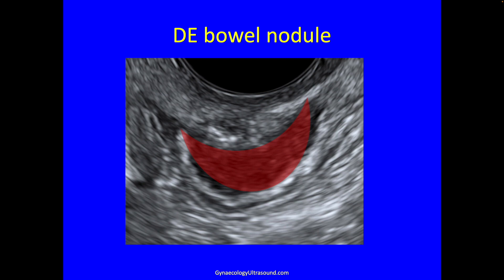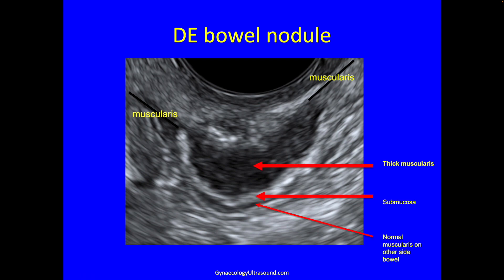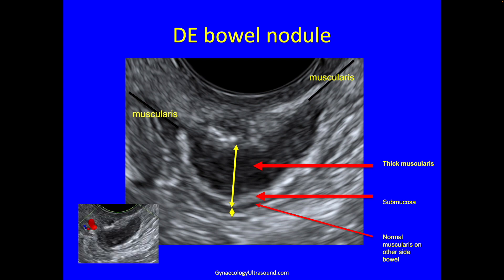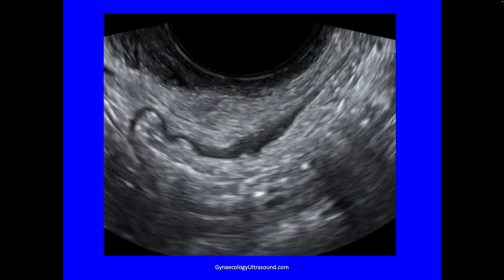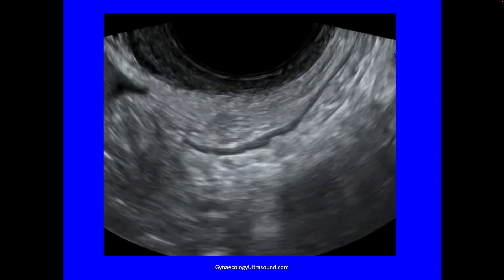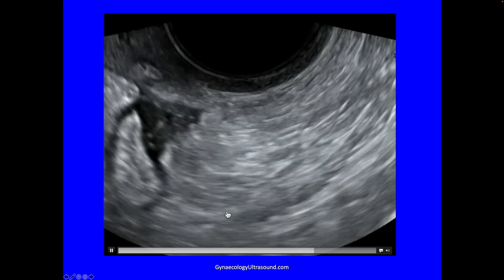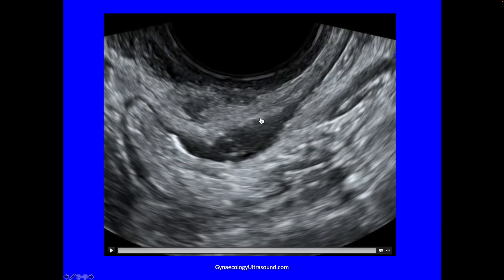Sometimes you will come across an abnormal bit of muscularis — it will have normal muscularis going in and out of it, and it is highlighted by very bright white, which is the submucosa and mucosa. Normal muscularis on the other side — the posterior wall is never affected by endometriosis — and you can see the disparity in the thickness of the bowel wall. Colour Doppler shows it doesn't really have much vascularity; if it did, you need to think of other pathology. Looking at the bowel nodule again in longitudinal plane, going slightly from side to side, you can see normal muscularis going in and out of it — this is a nodule of very disrupted, very thick muscularis.